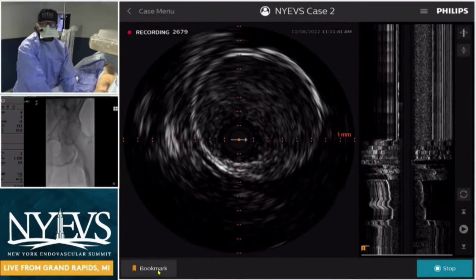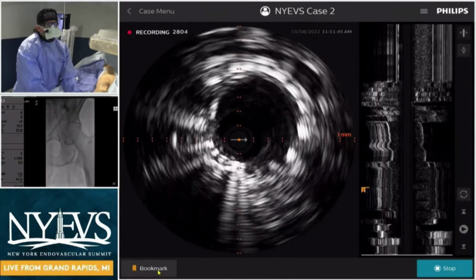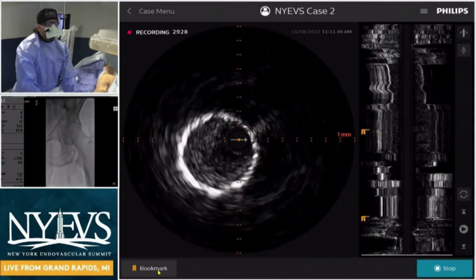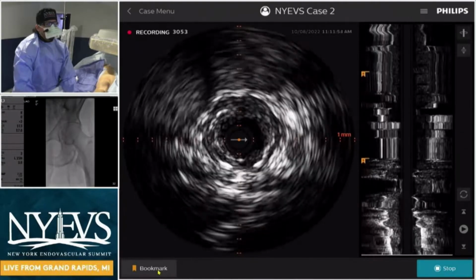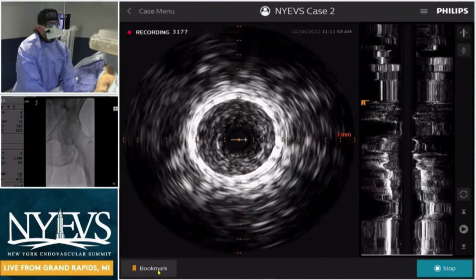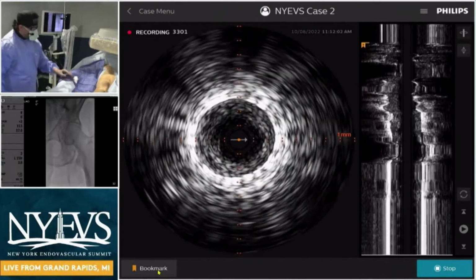As soon as you show us the IVUS of the lesion, I think they'll get a good idea of what they want to do. External iliac. Yeah. Here you go. Let me show you the lesion. It's in the stent. And right there. Okay. All right, guys. Looks like a lot of intimal hyperplasia, as Darren described, maybe with some underlying thrombus.